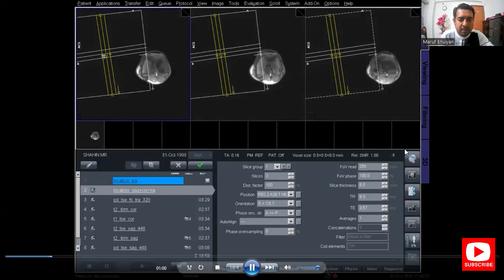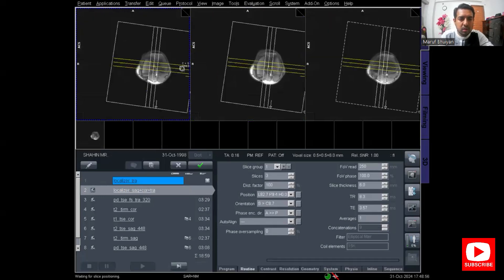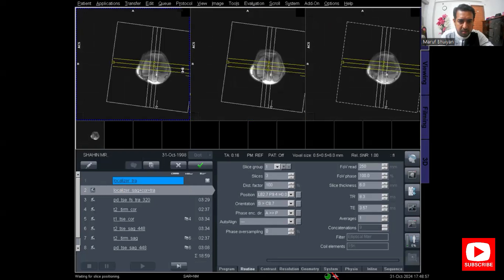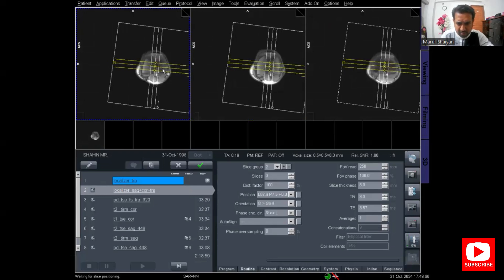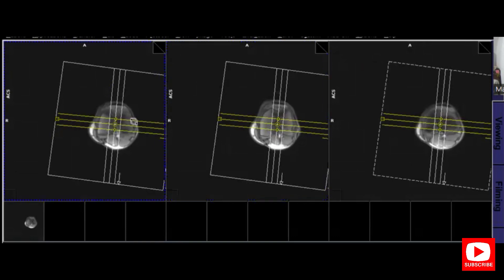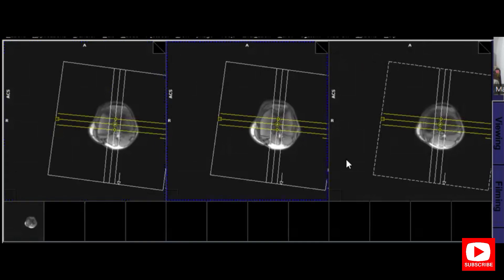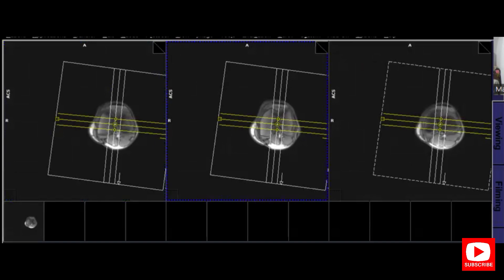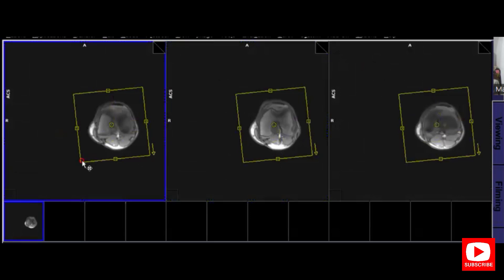After selecting the graphic overlay on, I move the slices on the axial image and angle the slices so that we get the proper image. Angle parallel to the lateral and medial condyle of the femur.